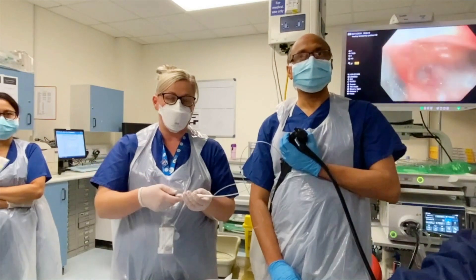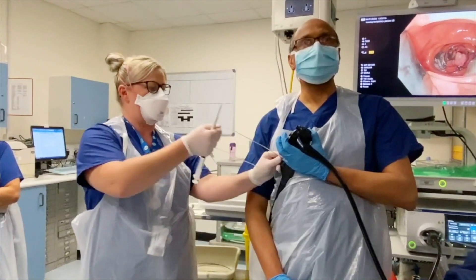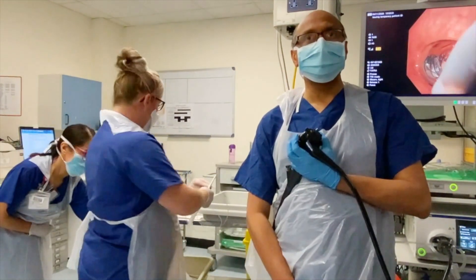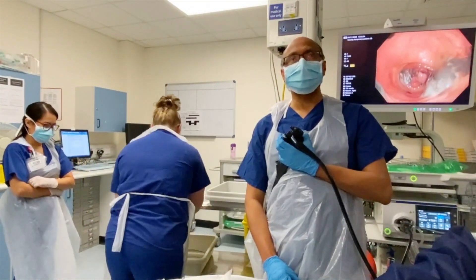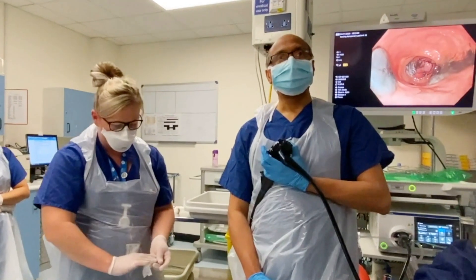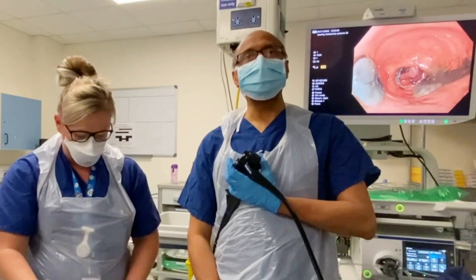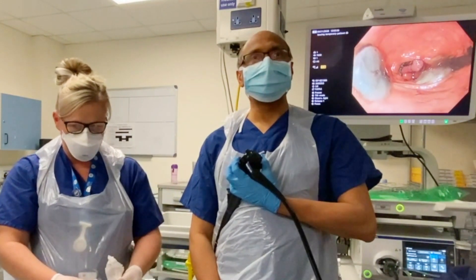We've got two tattoos diagonally opposite to each other. They're a little bit bigger than what I would normally want, but if the patient is going for a radical resection, it doesn't really matter. A submucosal bleb followed by tattoo on the anal side — we will put this in the report and there will be no confusion.